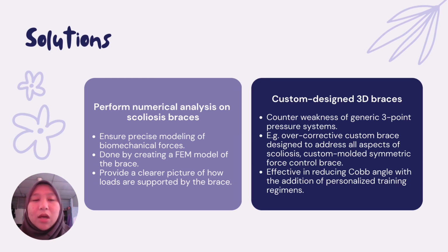A reliable finite element method, FEM, model can provide accurate biomechanical force modeling, leading to better brace optimization and effectiveness. FEM models help identify critical load-bearing areas within the orthosis, optimizing its design and ensuring proper spinal correction. Researchers have conducted a FEM analysis of a Boston brace, determining von Mises stress distributions and plotting major stress trajectories to highlight key force pathways in the three-point pressure systems. Generic scoliosis braces like the Boston brace typically use a three-point pressure system to prevent curve progression.